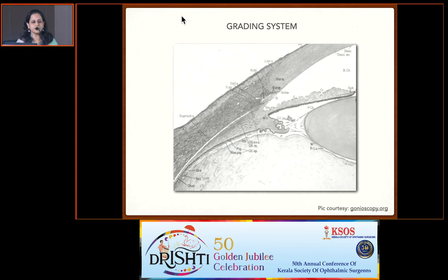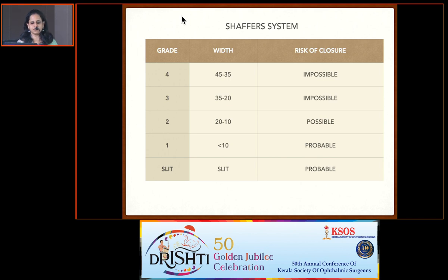Now, when you talk about the documentation, of course, you have to know the grading system. Schaffer system, already Dr. Manoj sir has covered it.